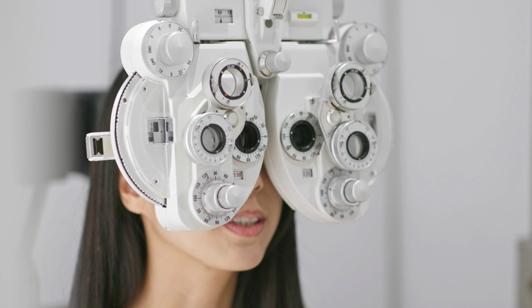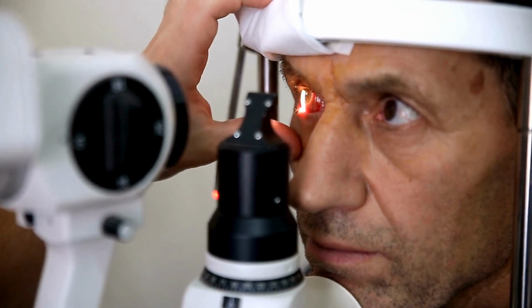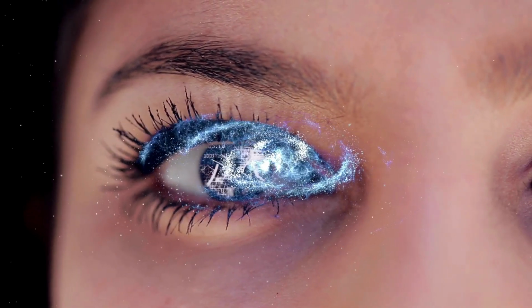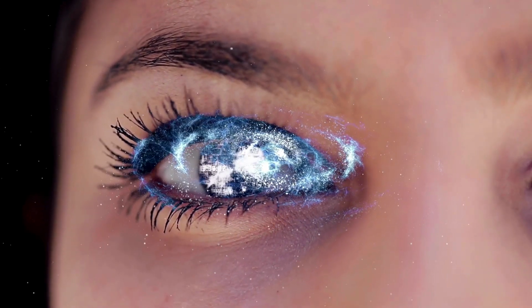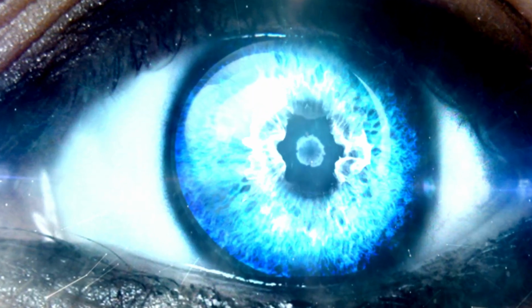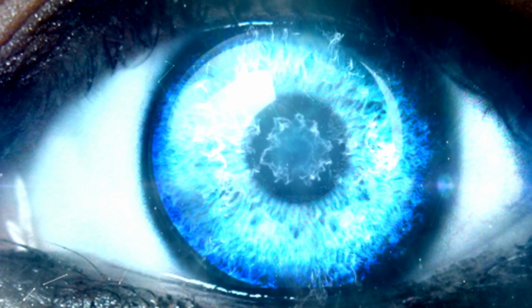Common types of maps produced by tomography-based corneal topography include the axial curvature map. This map depicts the curvature of the anterior corneal surface, displayed with a color scale representing the refractive power in diopter value at each point. Warmer colors, red, orange, and yellow, represent steeper corneal curvature, while cool colors, blue and purple, represent flatter curvature.